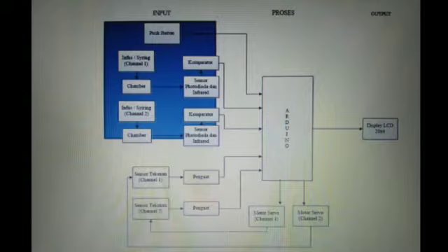When the power button is on, the power supply gets voltage from the PLN and supplies the voltage to the entire circuit. Before making a measurement, first select channel 1 or 2 that will be used and adjust the flow rate on the infuse pump or syringe pump to be measured.